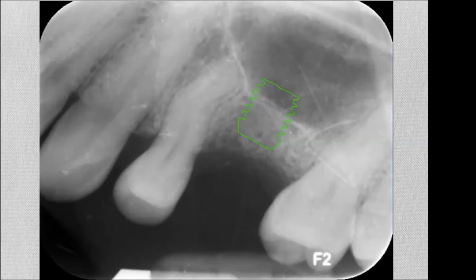Now notice the orientation of the overlay, okay? Like with every implant, what you should be focused on is the space of the crown. So we draw an imaginary line connecting the contact points, okay? And we try to have the implant's long axis intersected at its middle, like so, okay? And that's the goal. Now, this is all fine and nice with drawing, but let's see if we can achieve that clinically without a guide, okay?